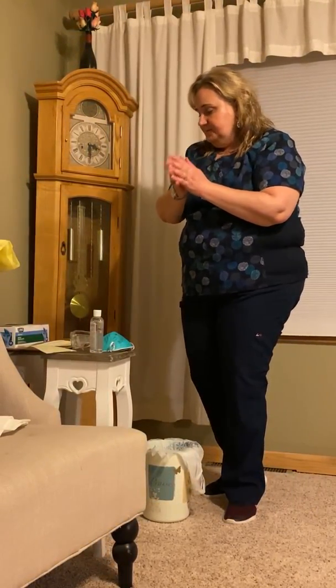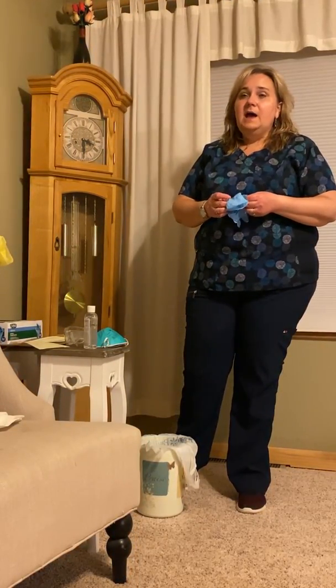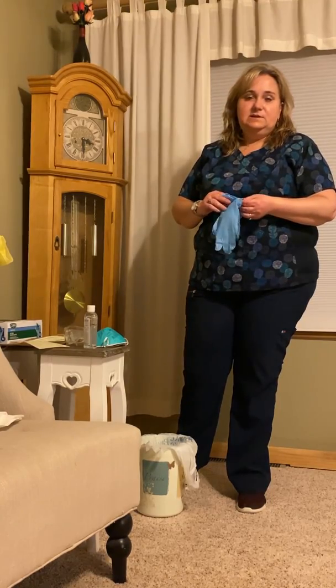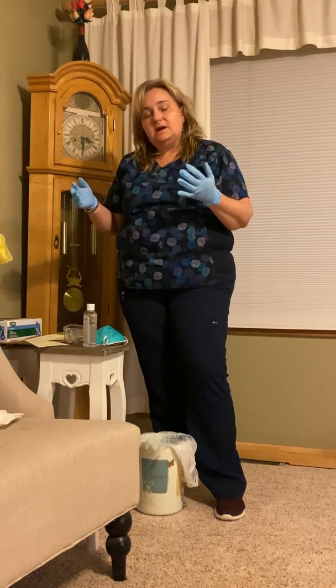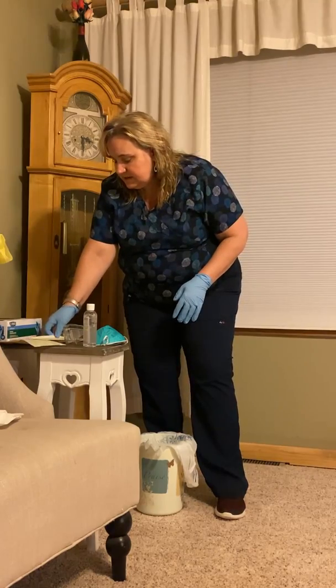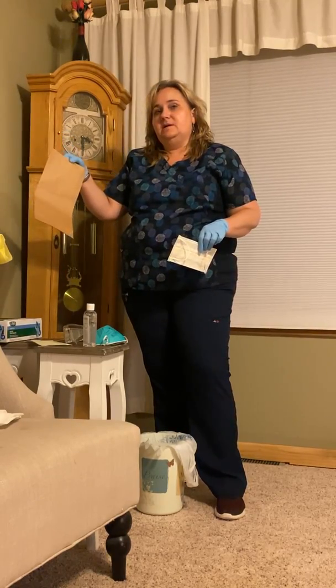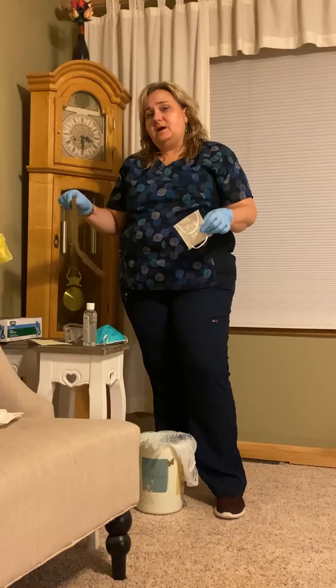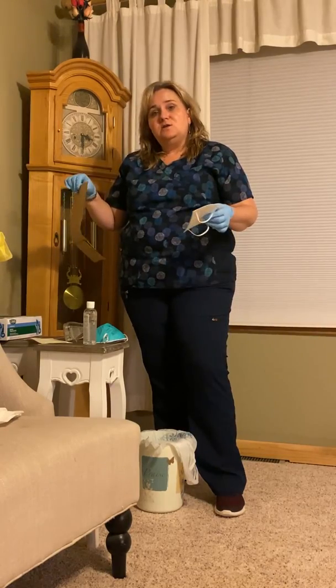Okay, so I'm going to assume that my mask is contaminated because I've used it before. So I would do my hand hygiene like I just did with the sanitizer. I'm going to get my gloves on before I ever touch this mask because it's been used before and I know that it's considered contaminated. Okay, so now that I have gloved hands on, I'm able to actually touch this mask. When I'm not using it, it should be in a brown paper bag, such as this one here, because this is going to allow it to air out, and it is recommended by the CDC to keep these masks we are reusing in brown paper, not in Ziploc bags.